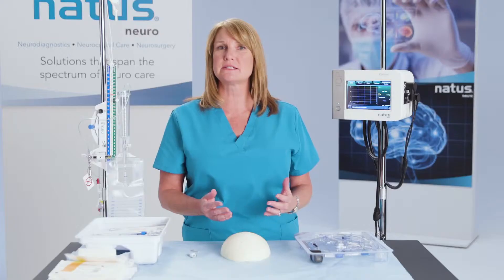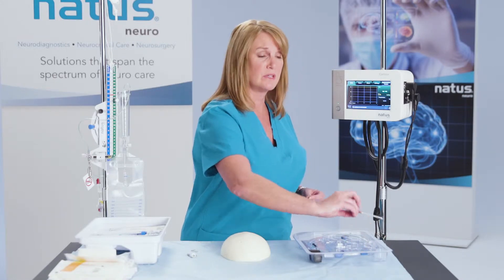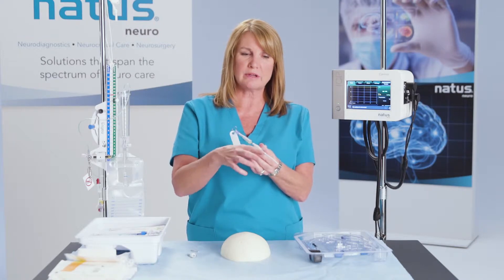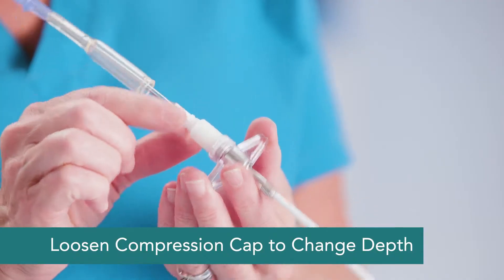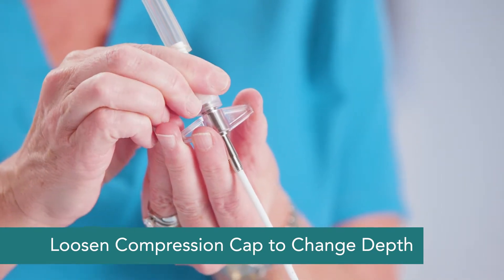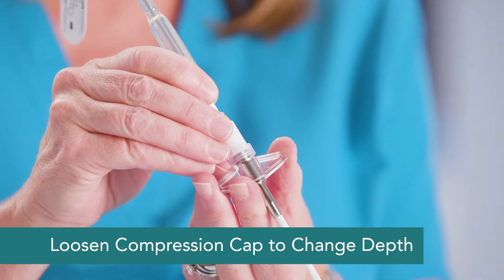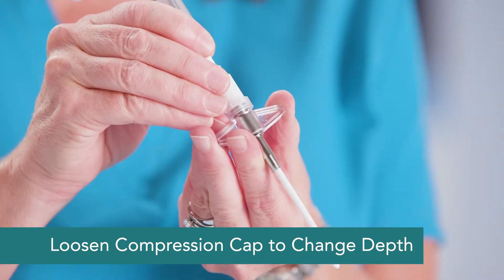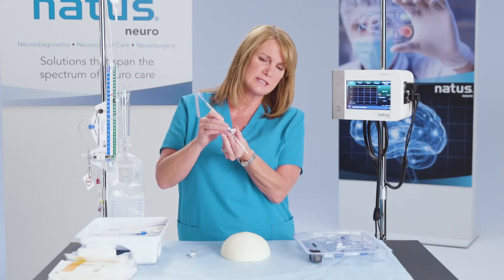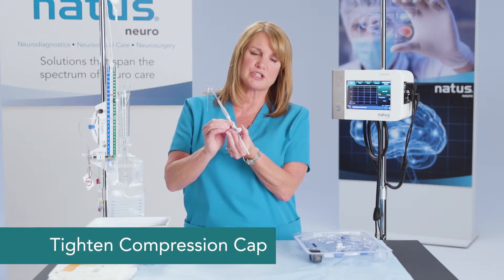Now we want to access the ventricles using the bolted system that has the ventricular catheter attached. You can change the depth of your ventricular catheter by loosening the compression cap and pulling back. You can set it at 5 centimeters, 6 centimeters, or 7 centimeters. I'm going to use the 6 centimeter depth here, so I'll tighten the compression cap.